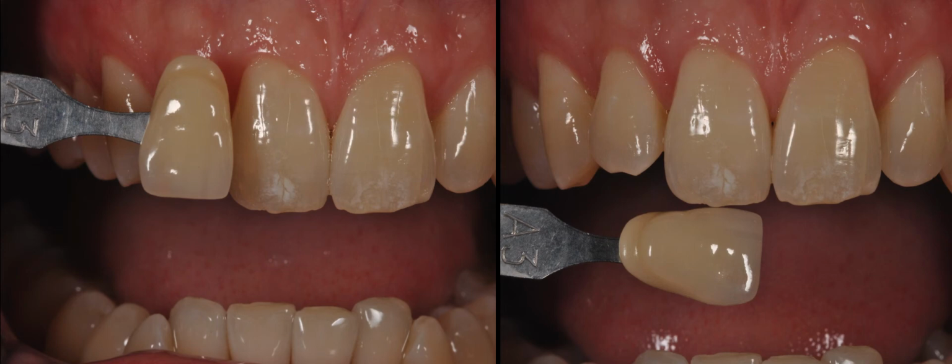Another common mistake, dentists do this all the time, they place a tab side to side with the matching tooth. Look at the shadow created by the tab. This gives the natural tooth a darker appearance and a false negative. Compare this position of the tab with the horizontal position. Same shade tab, different position, different result.